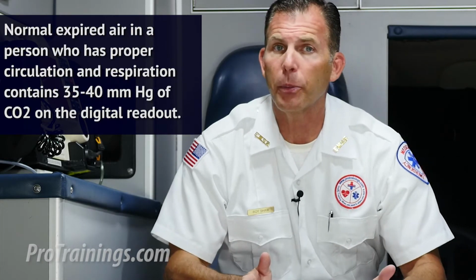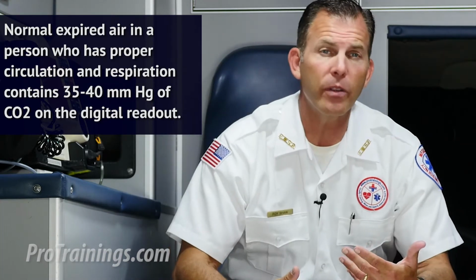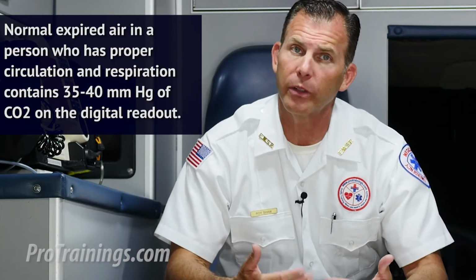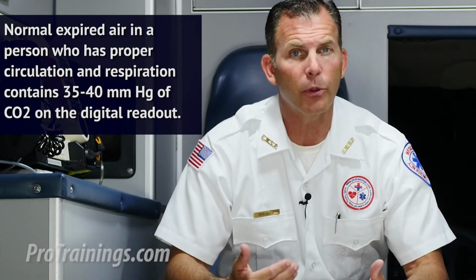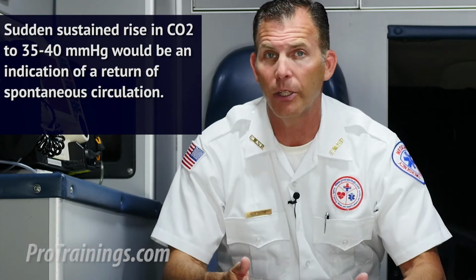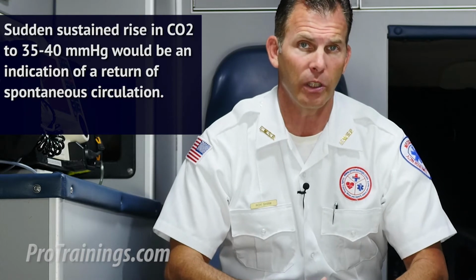Capnography should be attached in order to monitor the concentration or partial pressure of carbon dioxide in the expired air. Normal expired air in a person who has proper circulation and respiration contains around 35 to 40 millimeters of mercury of CO2 on the digital readout. If CPR was being performed and a sudden sustained rise in CO2 to 35 to 40 millimeters of mercury occurs, this would be an indication of a return of spontaneous circulation.